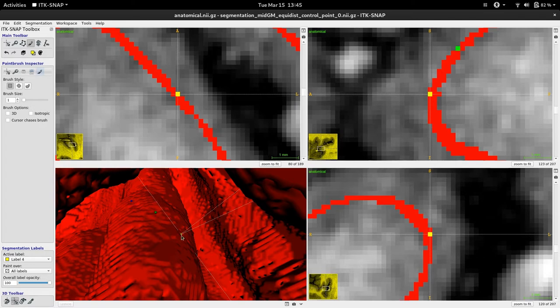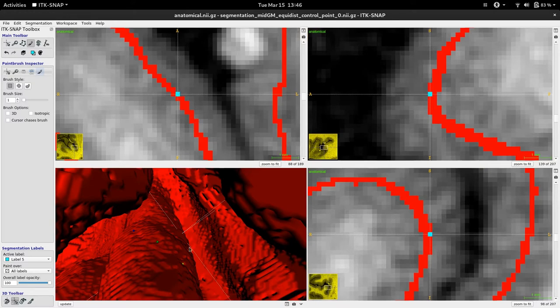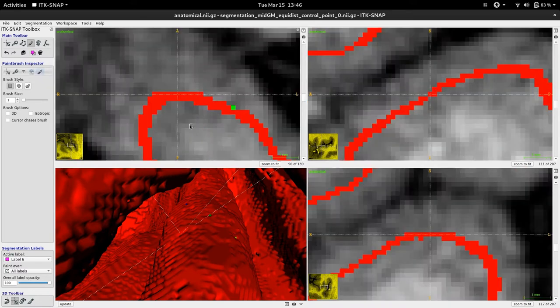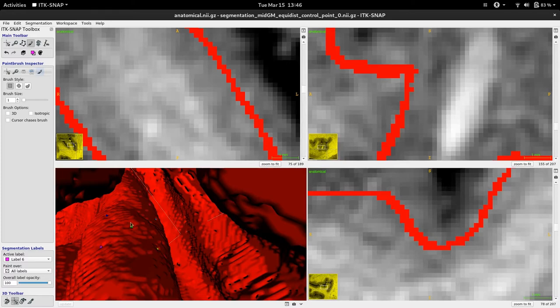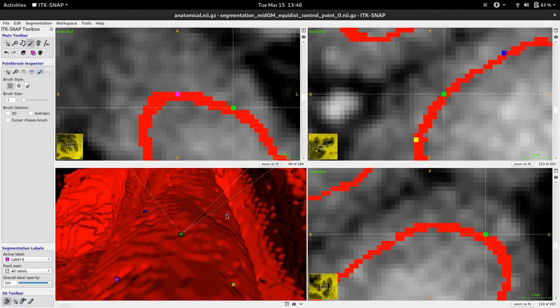So now we have these two extra points. Next, I am going to determine the other axis. Similarly, from the medial-lateral direction, I will click here. I would like it to be more or less orthogonal, but I am eyeballing this. The program doesn't ensure that orthogonality happens because we are now using the custom axis mode. Now I select label 5 and label one voxel. And here, I am going to select the next voxel, label 6, and click. There are now four extra voxels that I have manually labeled, and they will indicate my desired UV coordinate axis.